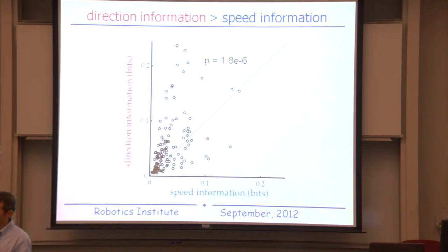And we know he's trying to get better at it because of the strategies that he'll take. So if there happens to be some kind of speed bias in the system, he'll approach the target from the low speed side so that he can go through it more slowly. So I think it's not that he doesn't understand what's required of him. He understands, it's just a serious lack of ability in the decoder.